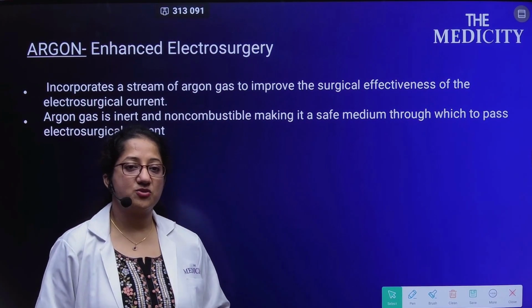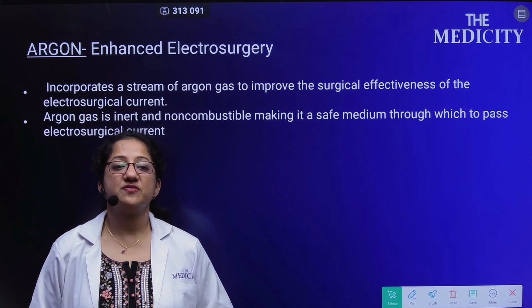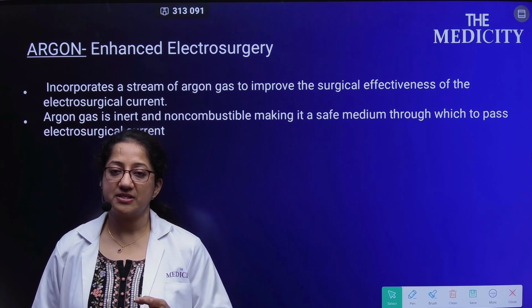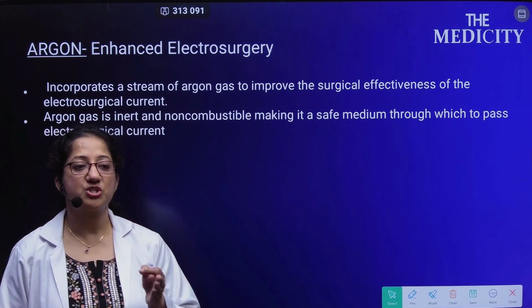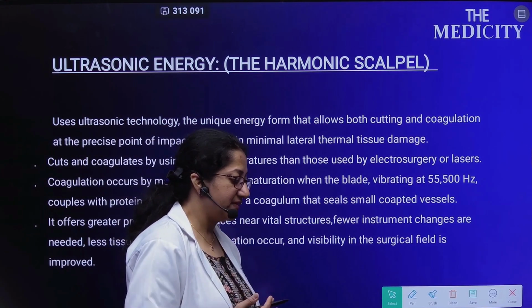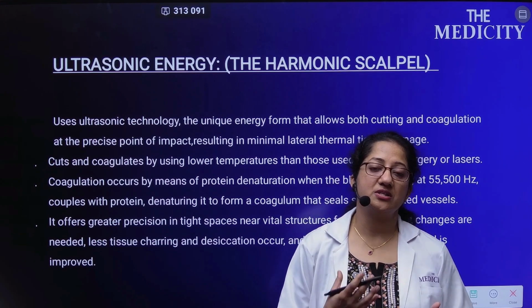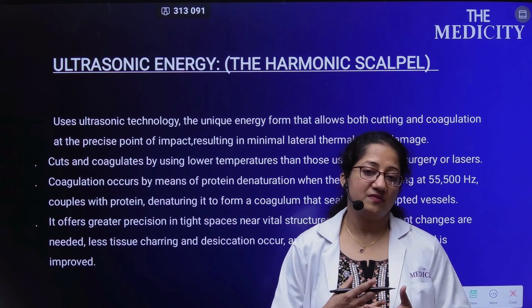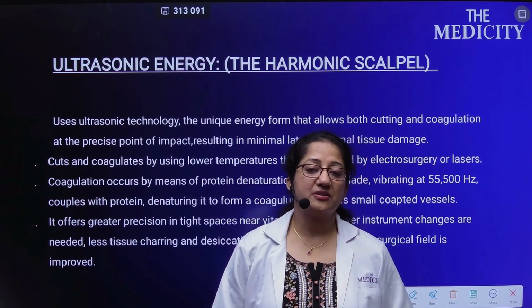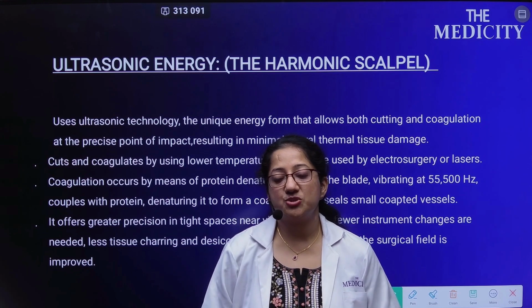Argon enhanced electrosurgery incorporates a stream of argon gas to improve the surgical effectiveness of the electrosurgical current. Argon gas is inert and non-combustible, making it a safe medium through which the current can pass. Ultrasonic energy. Now, the advent of the harmonic scalpel has changed our outlook towards hysterectomy, cystectomy, and various gynecological and surgical techniques. Basically this uses ultrasonic technology, which is a unique energy that allows cutting and coagulation together.